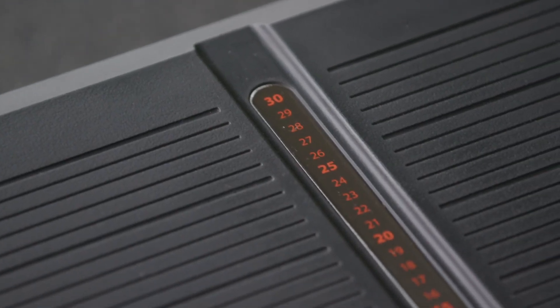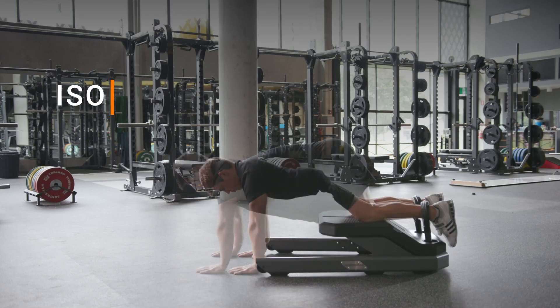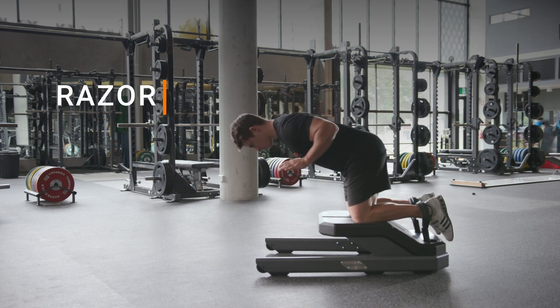With its easy-to-use and portable design, the NordBoard supports a range of positions and exercises to repeatably test and train isometric and eccentric hamstring strength.